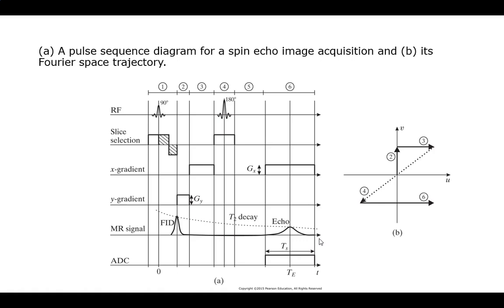If you do this and you don't put the Z, you'll be kicking every slice 180. So that means all those other ones are going to get some energy. When they get some energy, they're going to generate some signal. By putting in the Z gradient coil turned on when it's happening, it will only do it in the resonant ones. So now you can selectively kick the slice. You're trying to keep noise out, right? All those other slices are noise.